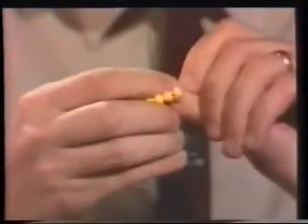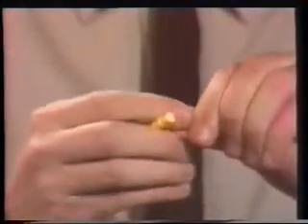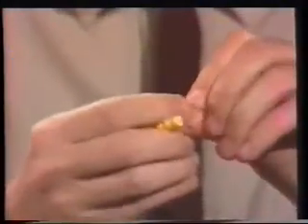But the important thing here is that blood can be present in the urine in minute amounts that cannot be seen with the naked eye, that don't contribute to a pink colour. And I'm now going to demonstrate that to you with the use of my very own blood, which I shall produce from my thumb. Have I produced? Yes, a tiny, tiny drop of blood. Let's just do that again a little bit more dramatically. Here we have a tiny, tiny drop of blood.